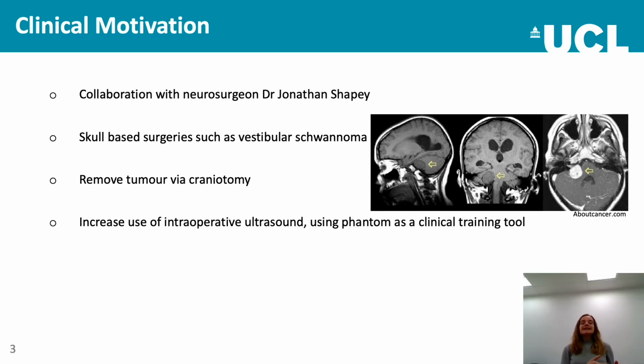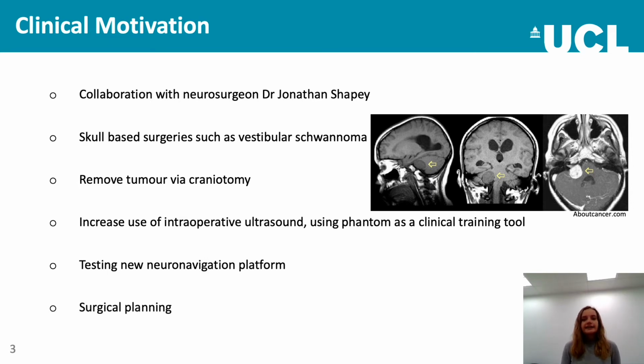But as the clinicians at the moment aren't familiar really with that technique, the phantom was needed as a clinical training tool. And also we needed a phantom for testing and validating a new neuronavigational system that Dr. Shapey's working on for this specific tumour operation. And finally, the phantom could be used for surgical planning, but that's not something that we investigated in this specific study.